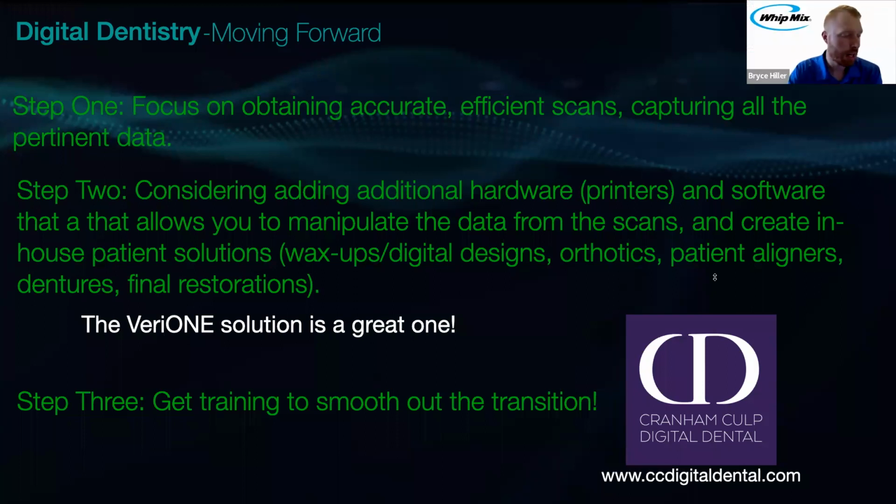Awesome. Another question that we have is, what is your scanning path for a fully edentulous arch? That's kind of what I just said. I don't think you can scan very well a fully edentulous arch. You might be able to do it on the upper, but even back by the tuberosities, it can be difficult.